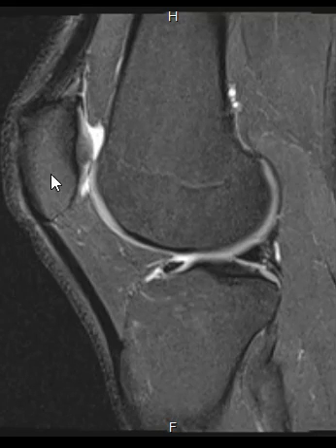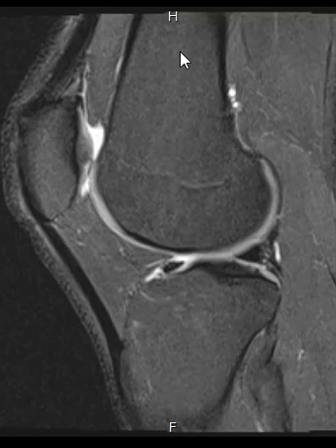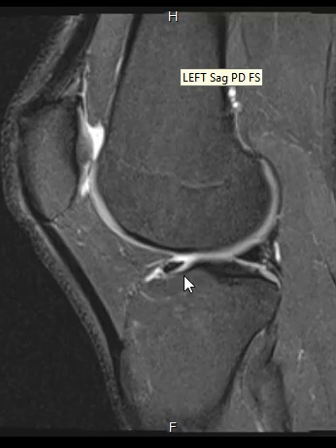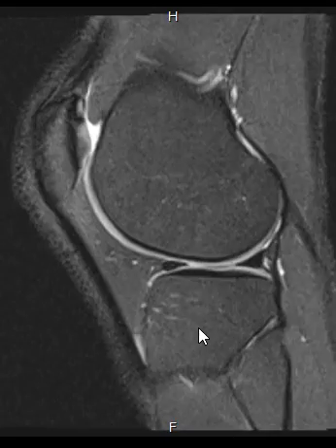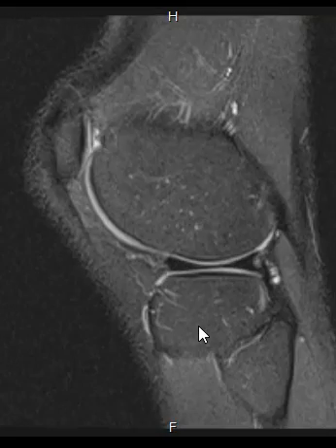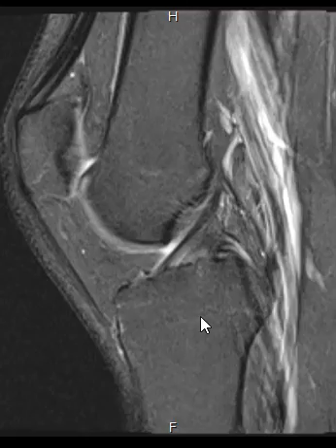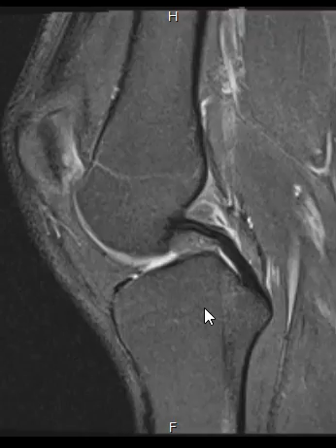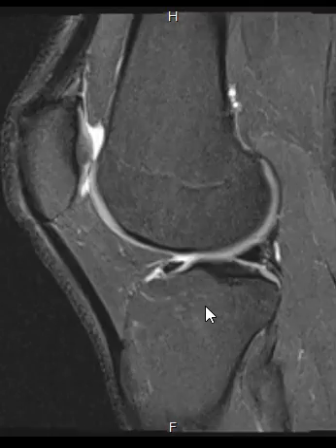Here's the patella in the front — we're looking at the profile. Here's the top, the femur, and here's the tibia down below. We can roll off to the outside, the lateral side, and off to the inner side, the medial side.